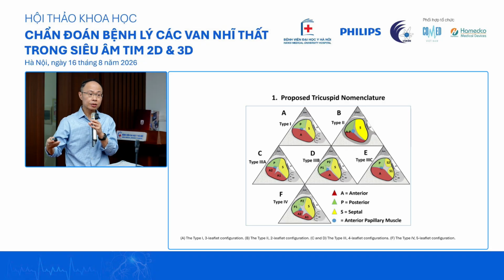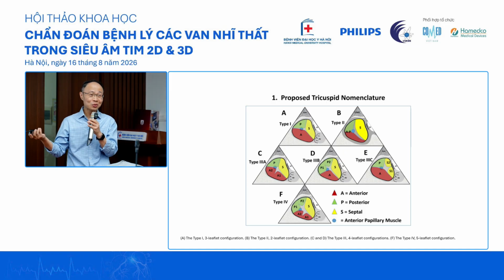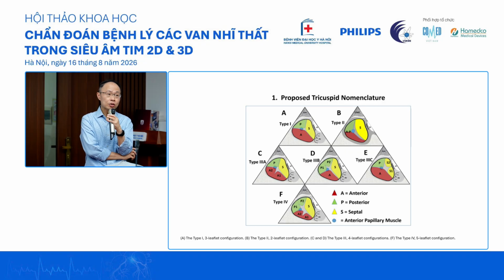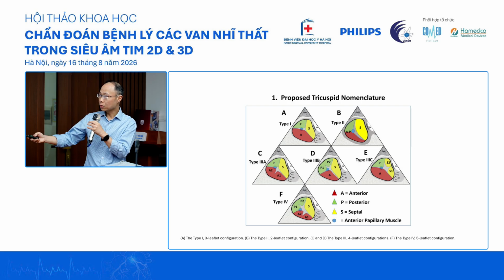And by the time the patient gets sent to our echo lab, for example, sent to me to do a transesophageal echo evaluation, it's not always easy to tell. In many of these patients, the right atrium is pretty dilated as well. Some of them are giant. So your tricuspid valve becomes a very distant structure away from your esophagus. On that note, I will share with you later on.